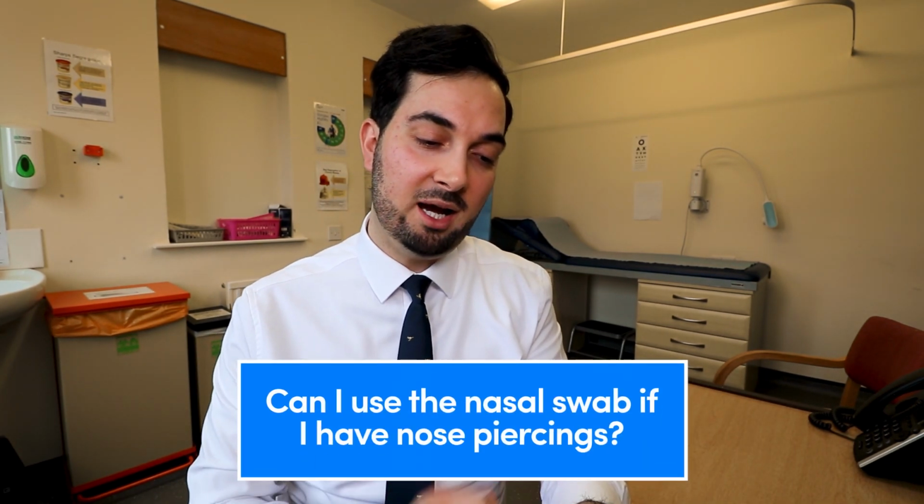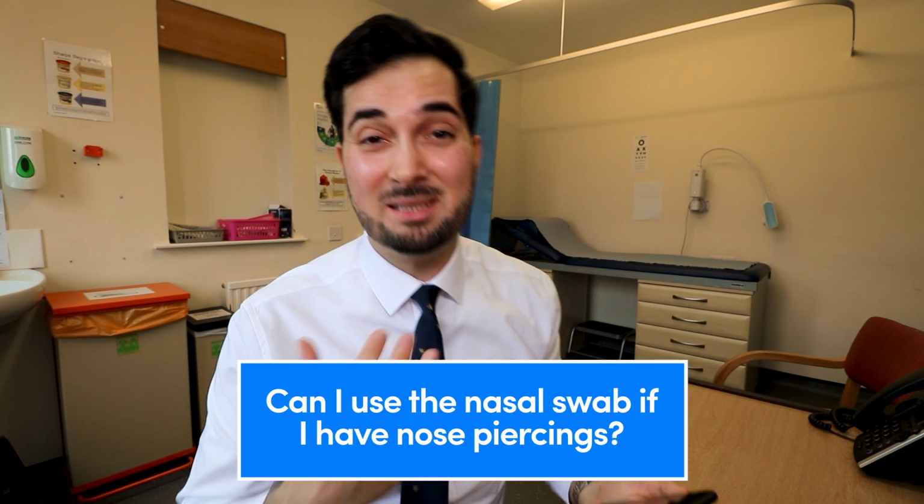The next question is, can I use the nasal swab if I have nose piercings? The simple answer is yes. However, if you're only using one nostril, for example, let's say your piercing is in your right nostril, then you can just use it in your left nostril, okay? But if you need to use both nostrils, then you just need to take your piercing out and do the swab in both nostrils.